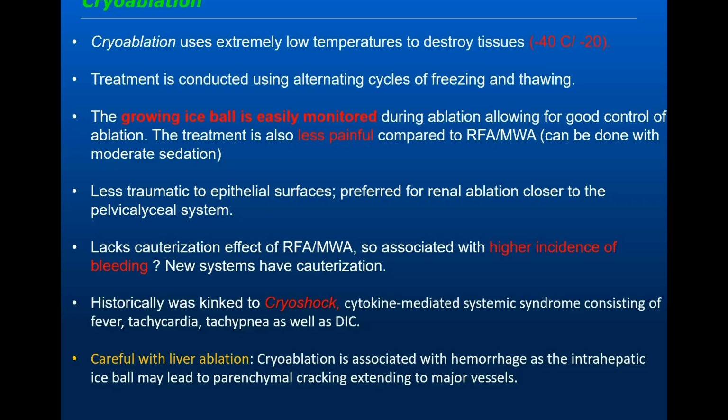Now, the disadvantage is we do not have the cauterization effect of radiofrequency or microwave. So it is usually associated with a higher incidence of bleeding. Although the new systems now have included some ablation, what we call tract ablation. So this provides some kind of cauterization that minimizes this. Cryoshock is something that was there before. I honestly didn't see it in my current practice, but this is something that I just wanted to throw here so that you have heard about it. It was some kind of a cytokine-mediated reaction that was noted with some cryoablation.